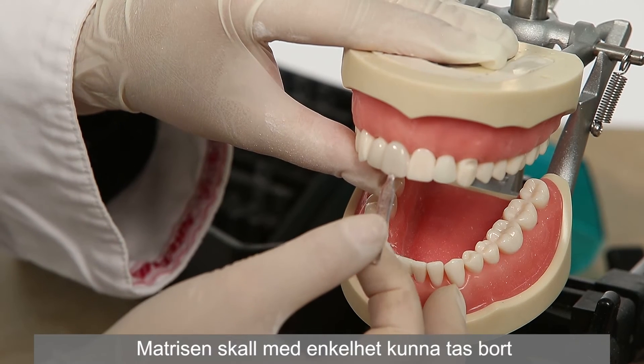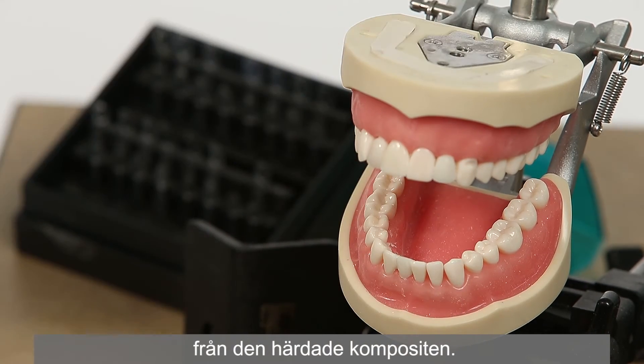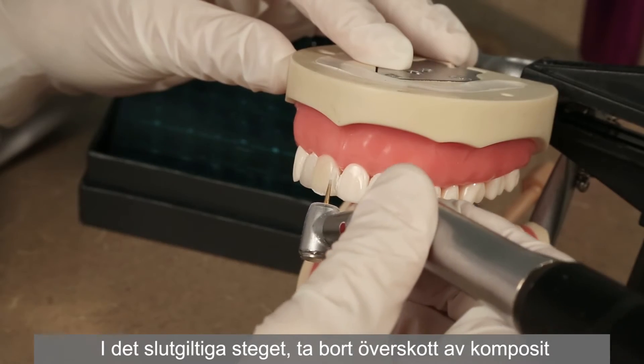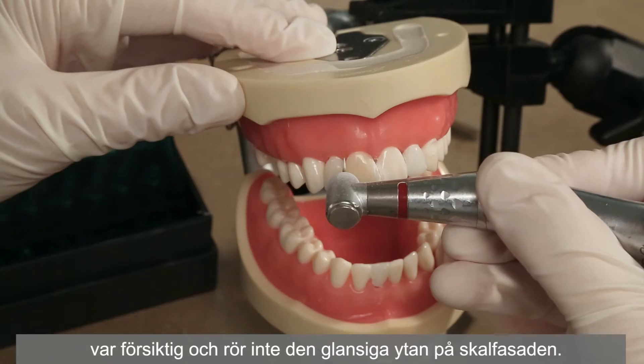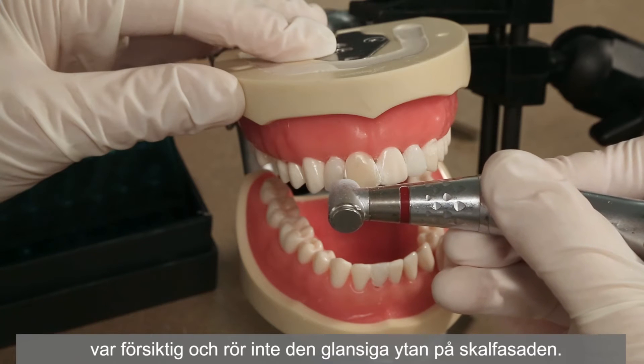The template should easily be removed from the cured composite. In the final step, remove excess cured composite from the periphery with an extra fine finishing burr, taking care not to touch the glossy finish of the veneer.